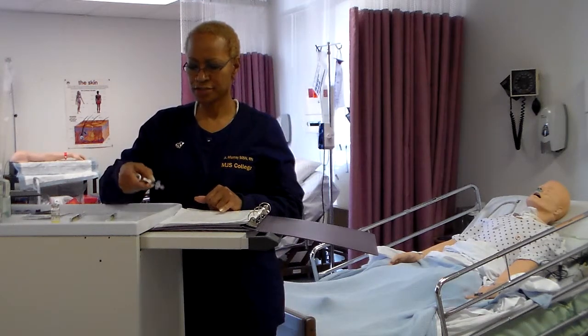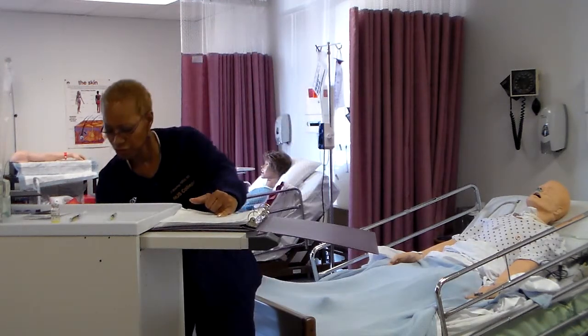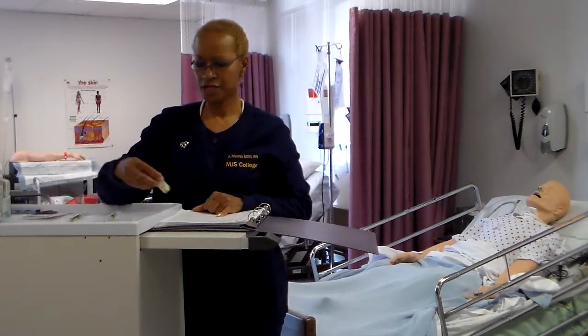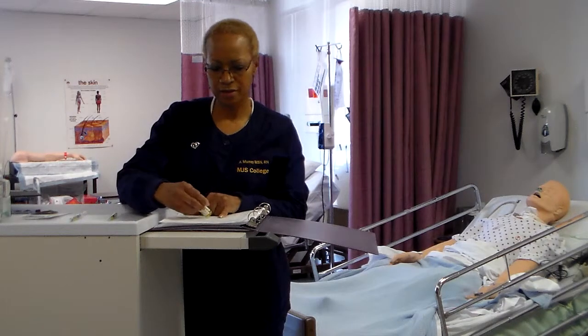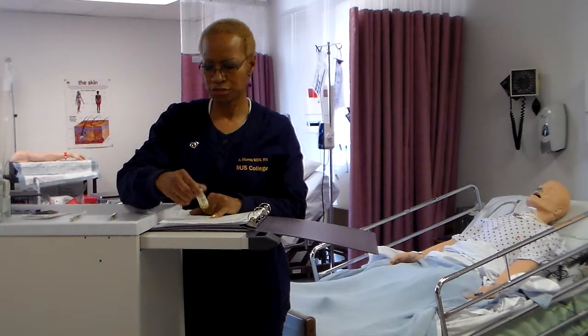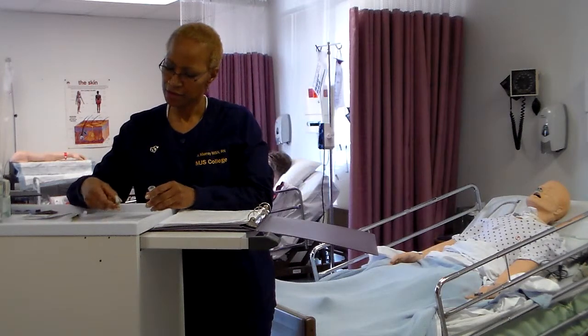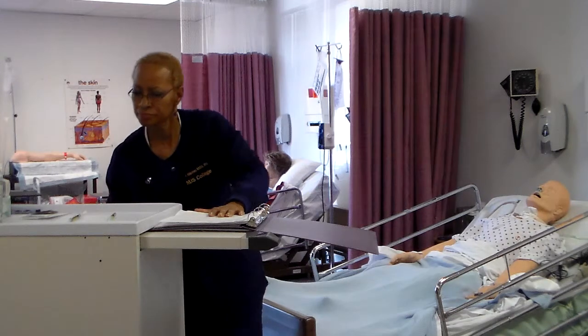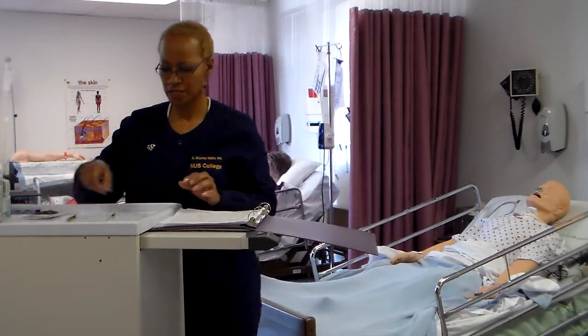You know how much you're going to give, and then return it to the drawer. For your next med, same thing. Expiration, the amount, and return it to the drawer. And then the same thing with your 3rd medication.